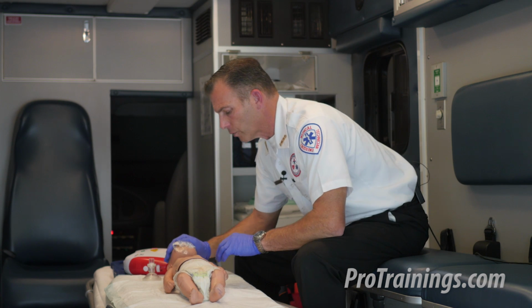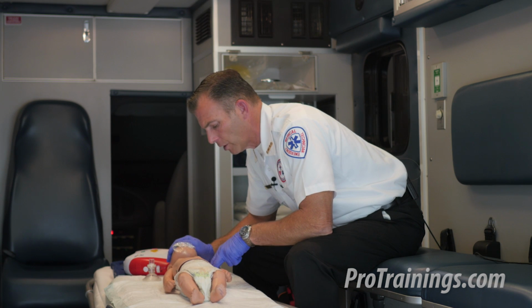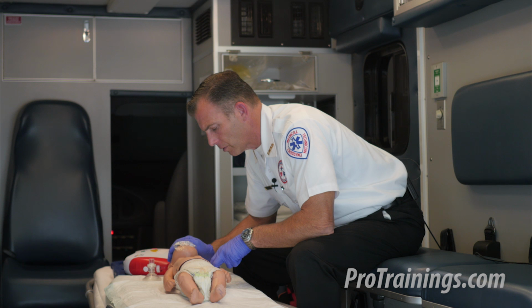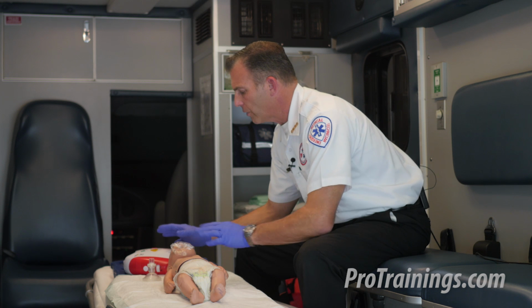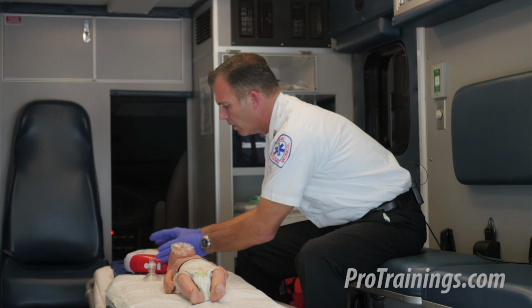Now I'm going to assess for regular breathing, normal breathing, and a brachial pulse. The baby has no pulse and is not breathing normally. But because I have the AED, I'm going to go ahead and start it now.